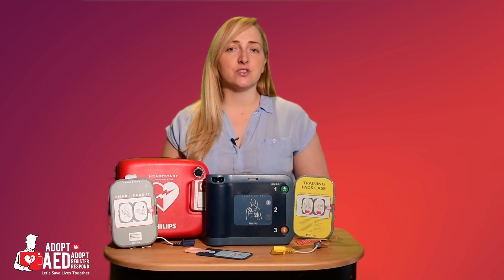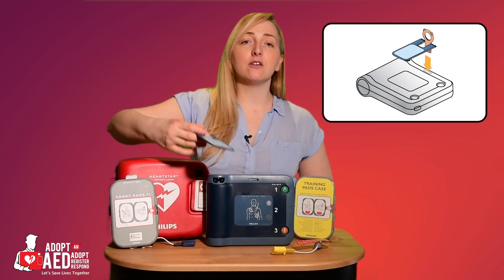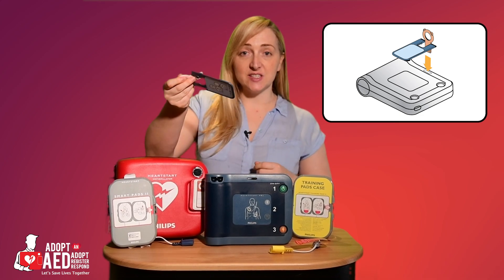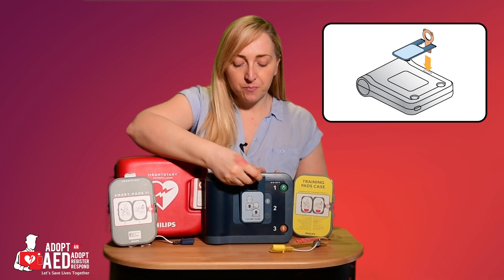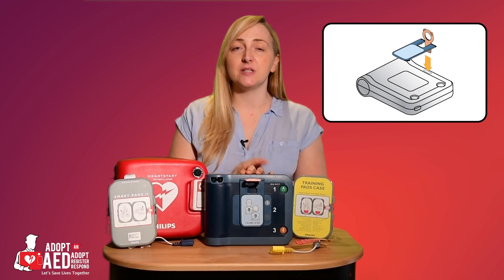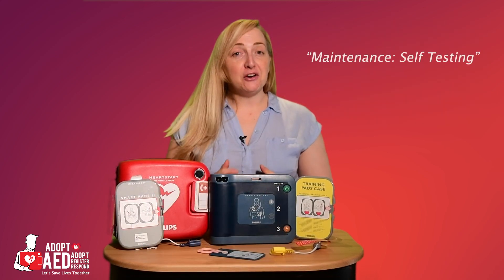The HeartStart FRX features a unique key that allows you to use the same pads for both adults and children. By simply inserting this key into the FRX, the AED automatically adjusts the shock strength and adapts to provide pad placement and CPR instructions for children.